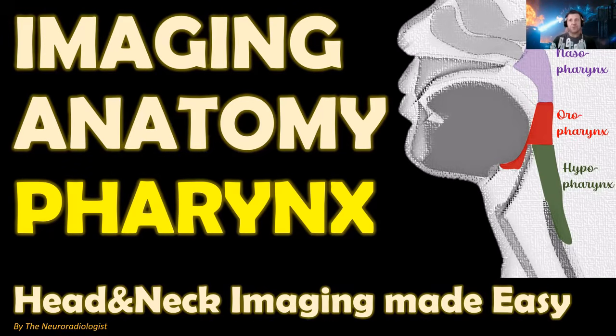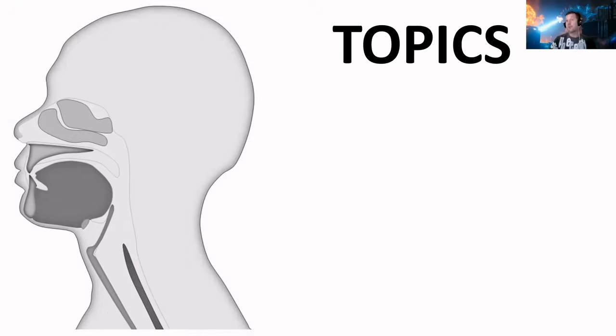I am a neuroradiologist working in Ghent University Hospital in Belgium, and welcome to this video on imaging anatomy of the pharynx. In this video, I'm going to talk about the anatomy of the pharynx as seen on imaging studies of the head and neck, and this presentation will consist of 4 parts.